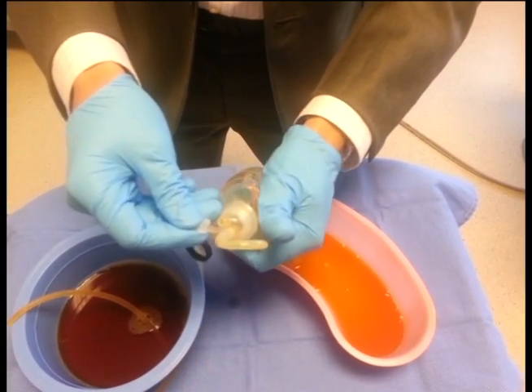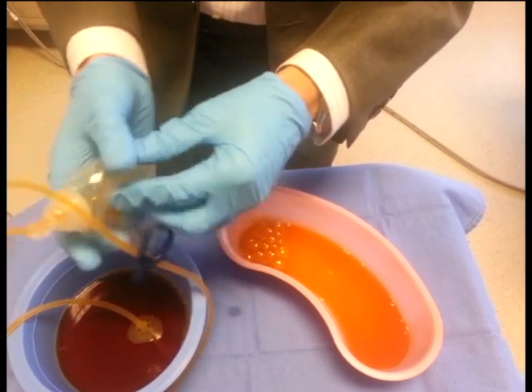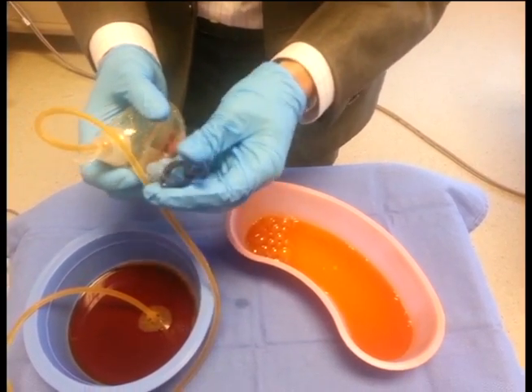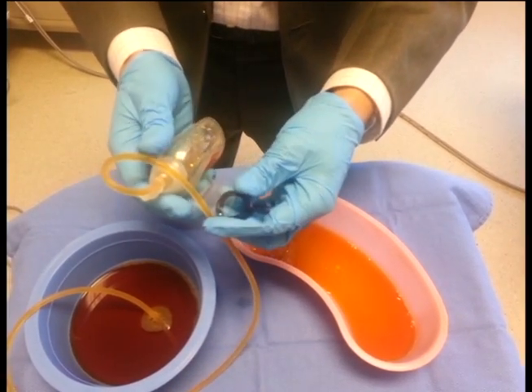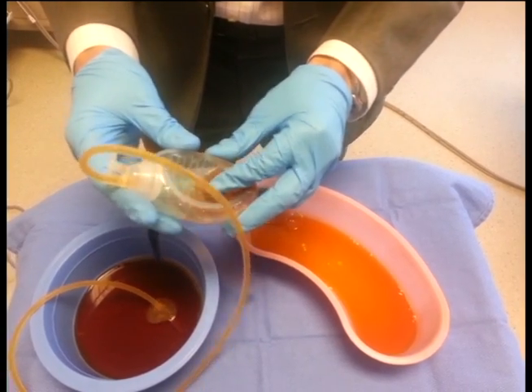To recreate the suction, squeeze the bulb and replace the cap. This clip here can attach to your clothing to avoid any tension or pulling on the tubing from the surgical area. You should record how many times you have to empty the bulb and what the volume level is at each of those times.